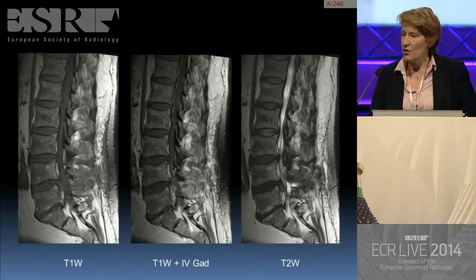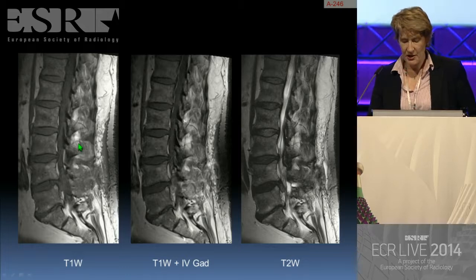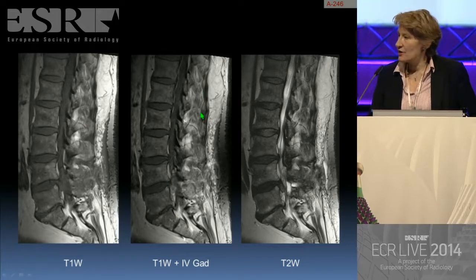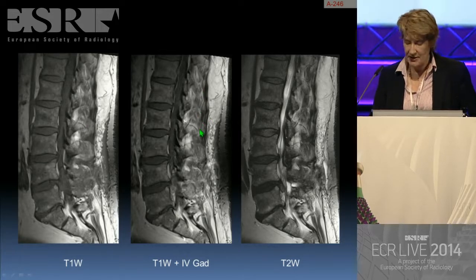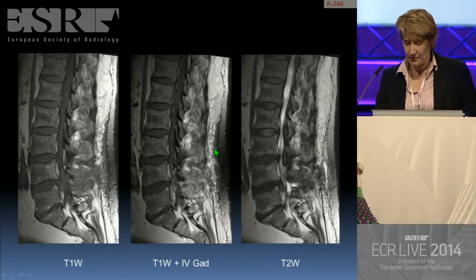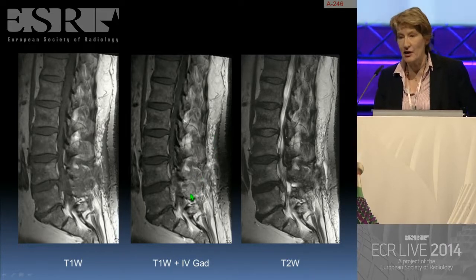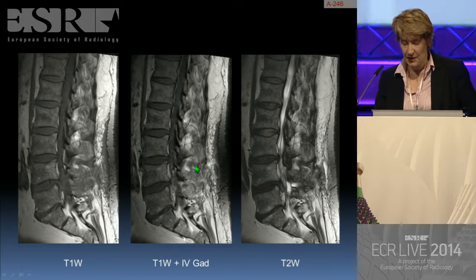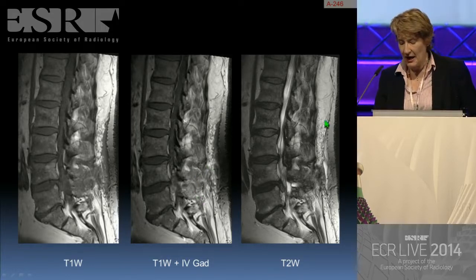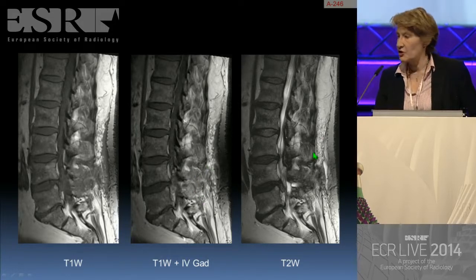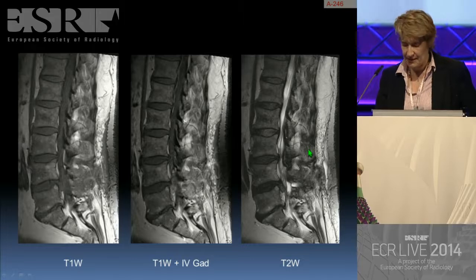Here one can see the sagittal T1-weighted study, the sagittal T1-weighted study post-intravenous gadolinium, and the sagittal T2-weighted study. We can appreciate that the surgery was carried out at the L4-L5 level, with enhancing soft tissue here at the back.